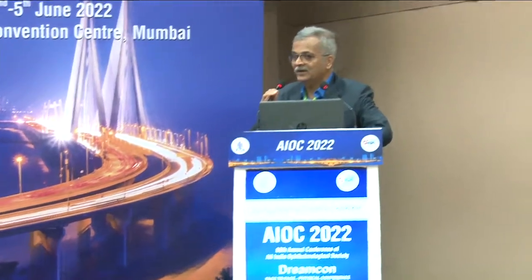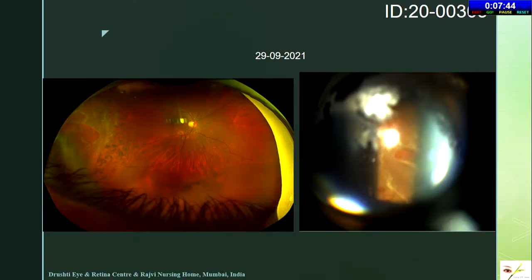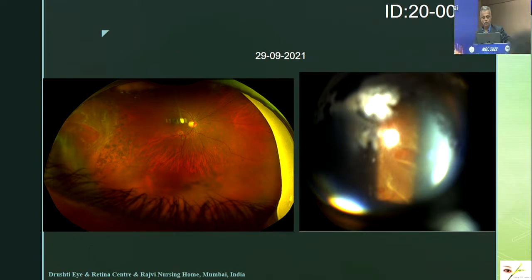Now, normally, as Preetam said, in primary vitrectomy, first surgery, we would use gas, C3F8 gas. For inferior breaks or a patient who wants to fly to an outstation, we use silicone oil. But the preferred choice is C3F8 because it remains in the eye for almost 2 months, and that is the time when I think PVR is active, and it gives much better buoyancy and tamponade effect. What I am going to do now is take you through different clinical cases which I have treated, as all the basic topics are covered.